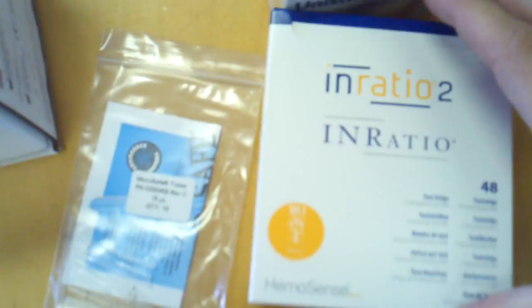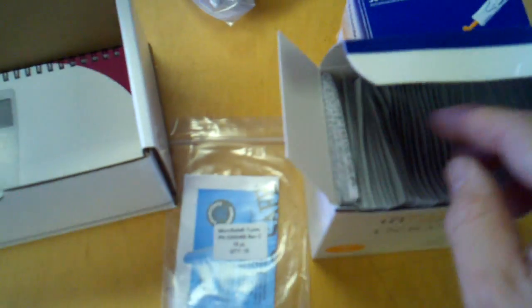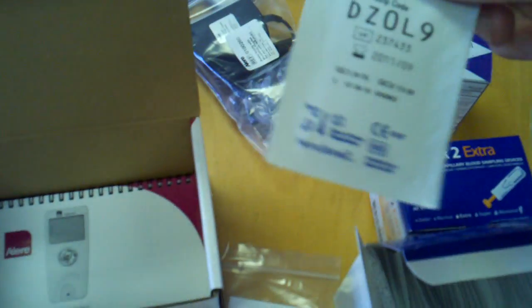Every time you order the welcome kit from us, you receive this package with all the things you see included. And of course, the strips. This is a box of strips — we sell them in allotments of 48, and also in allotments of 12. Keep in mind, these are non-refrigerated, and they do have an expiration date, which is very important. We typically always have boxes of strips here if you need to get them quickly. The expiration date on this is September 2011 — it's usually about a month.